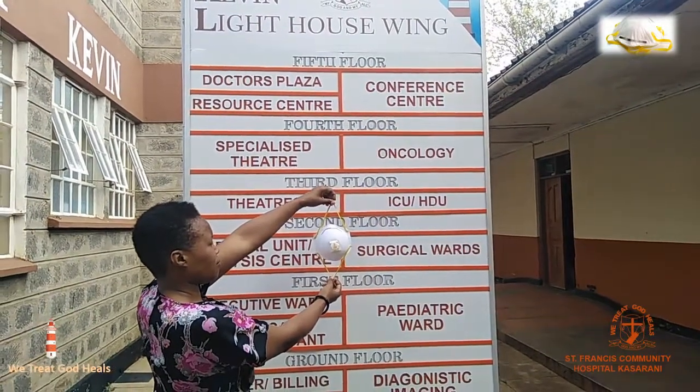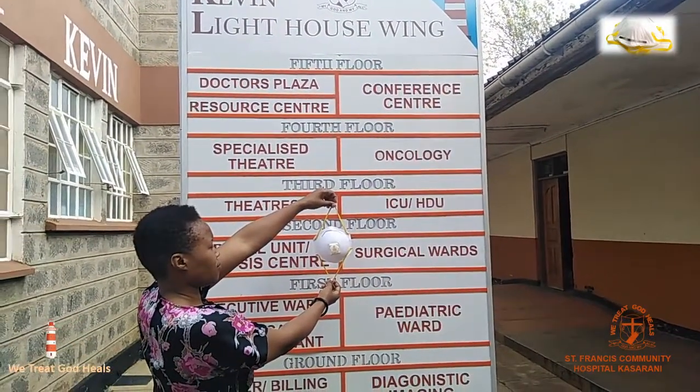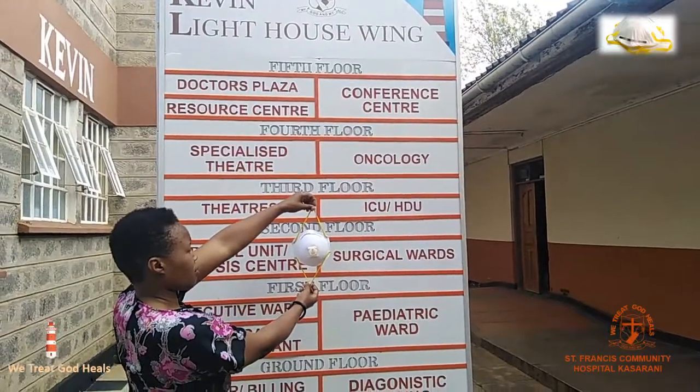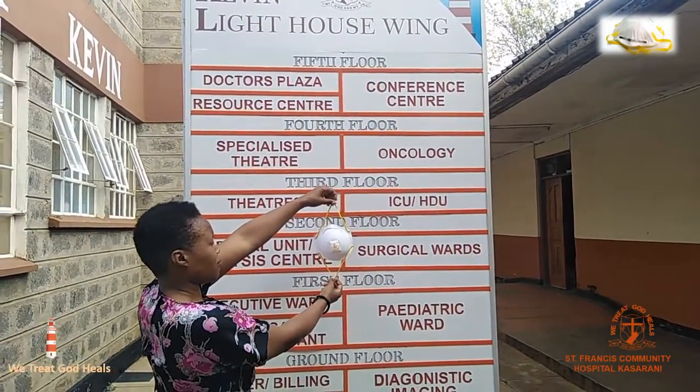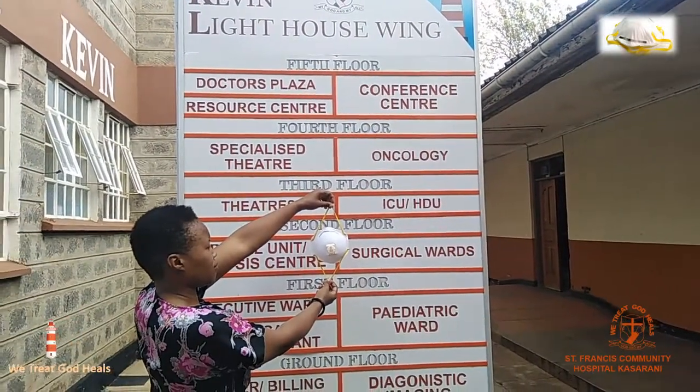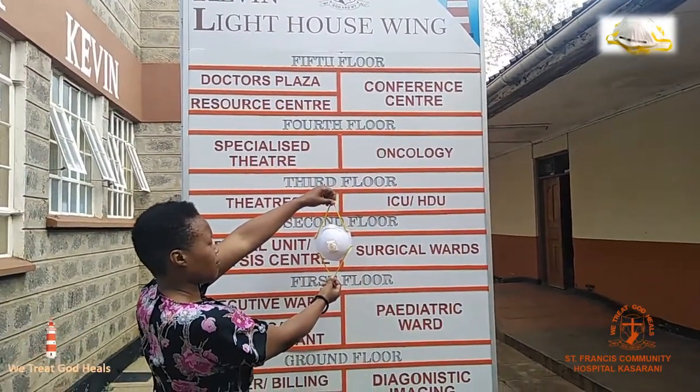St. Francis Community Hospital, Kasarani, urges you to protect yourself and your loved ones from COVID-19. On this note, we learn how to put on an N95 mask.